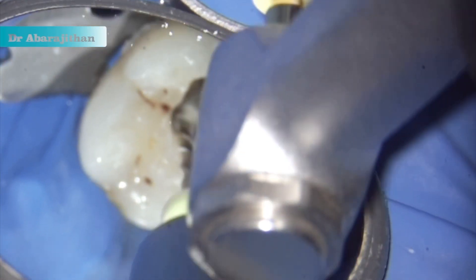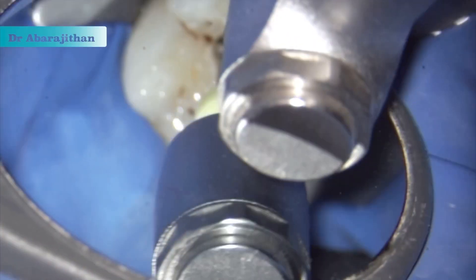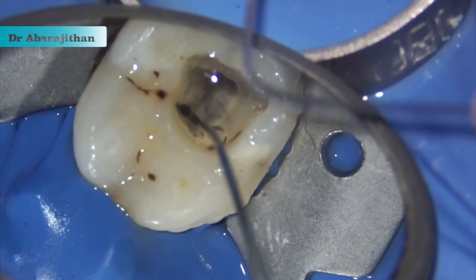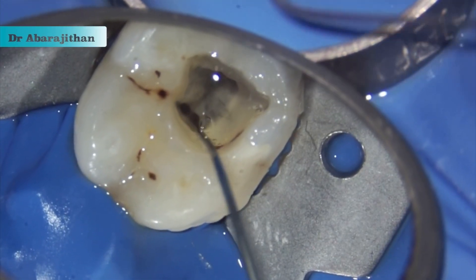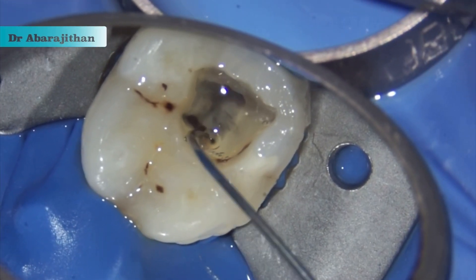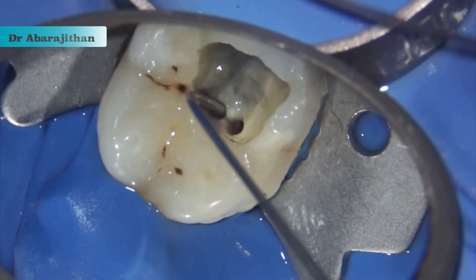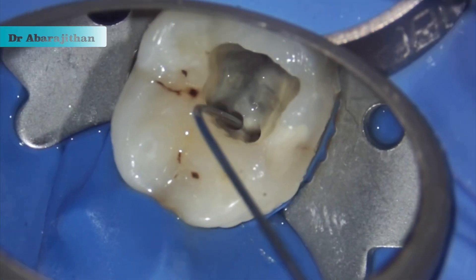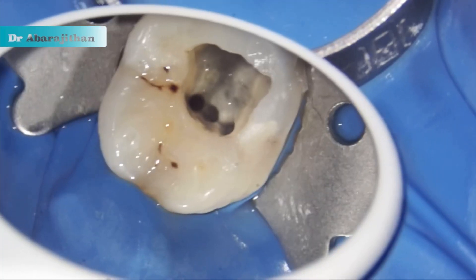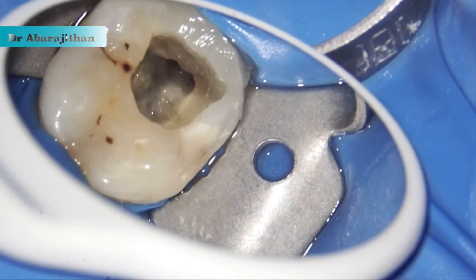All the canals are then thoroughly irrigated with active irrigation. As I aspirate from the middle mesial canal, I could see the irrigant disappearing mainly from the mesial buccal canal, which confirms the communication between them.